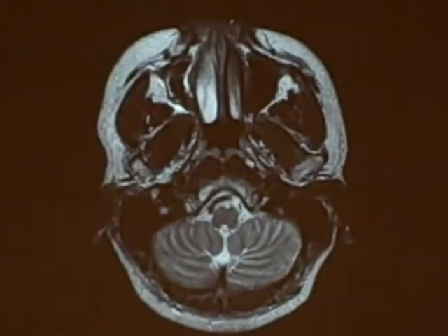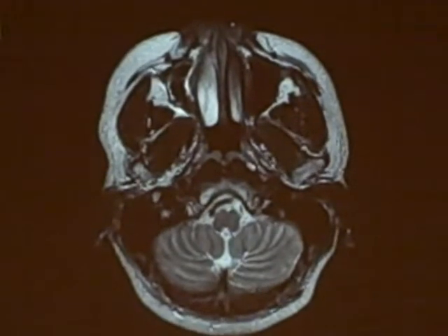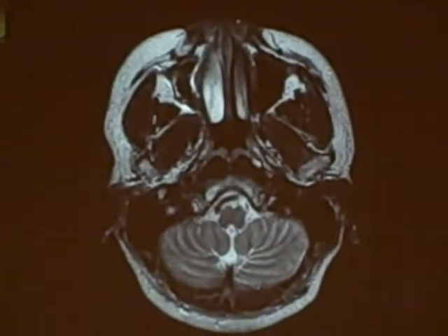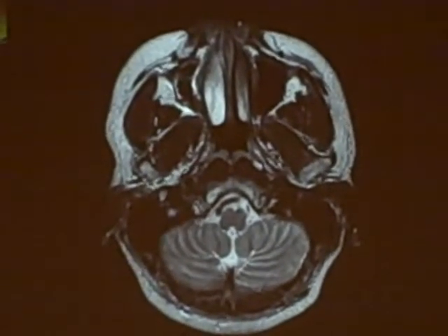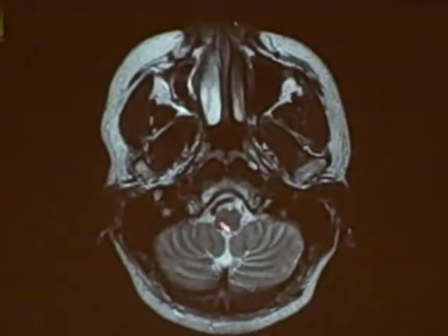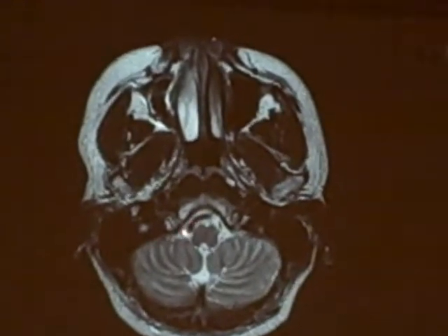In this MRI sequence that I show you — in fact, on almost all MRI sequences — the flowing blood always looks dark. So any time you see something like this, you know that's a blood vessel.